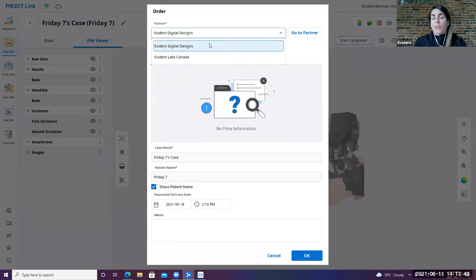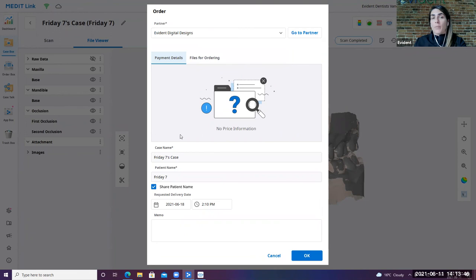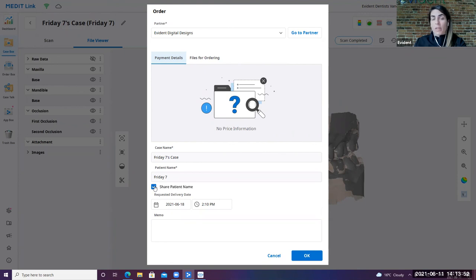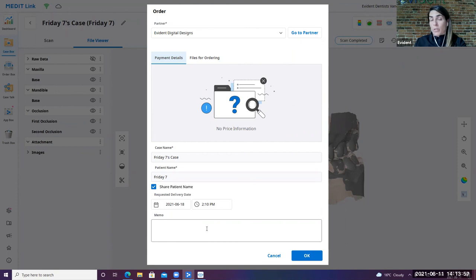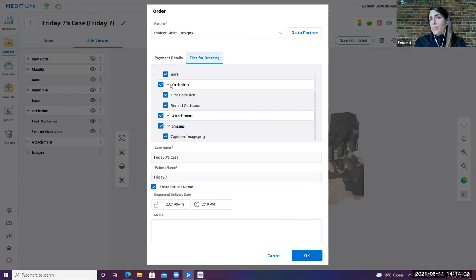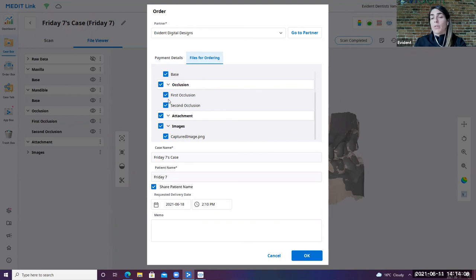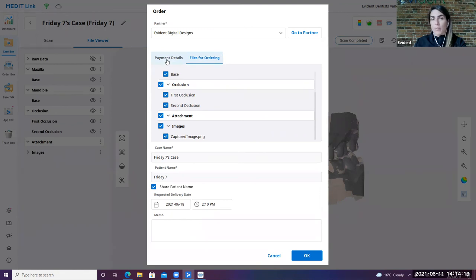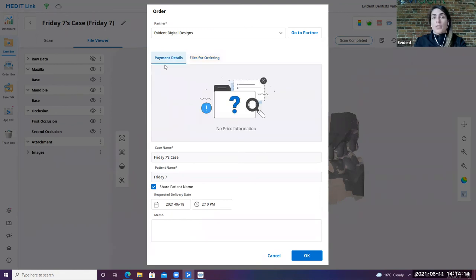So we're just waiting for the transfer to be complete. So here we're able to select our partners. So we've got two partners listed here. You can go ahead and share the patient's name, depending on your state laws or where you're located. It is an international product. So they have the ability to untick that. You can include your delivery date. And again, any additional memos to the lab that are needed can be indicated here. If say, for example, you've got multiple pictures or multiple occlusion that you don't want to send, you can select all of those under the files for ordering. And then that way you're only sending the lab what they're needing rather than anything excess that might not be of any benefit to them. So once that's all taken care of, you can just hit OK.